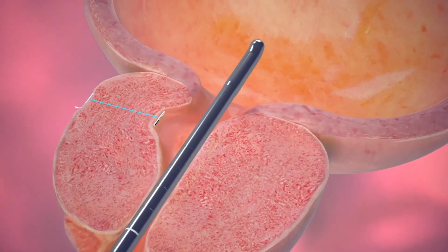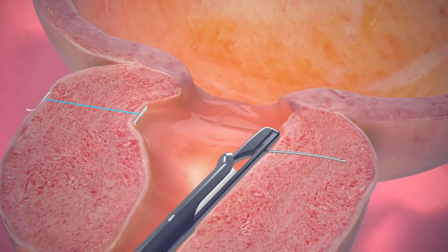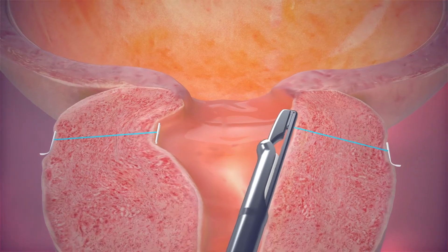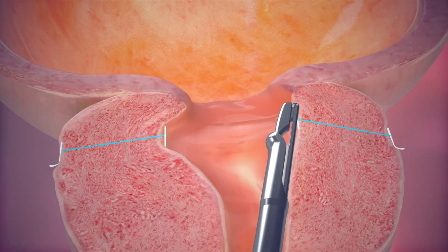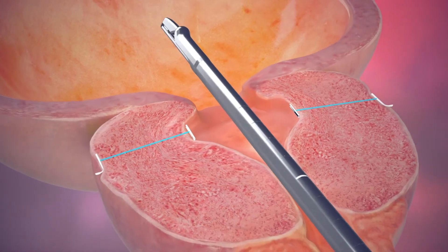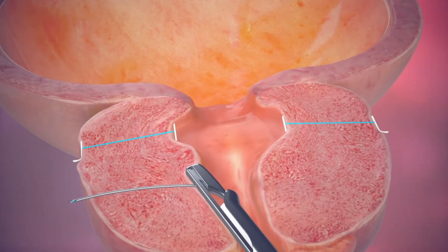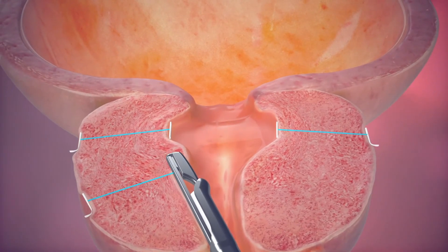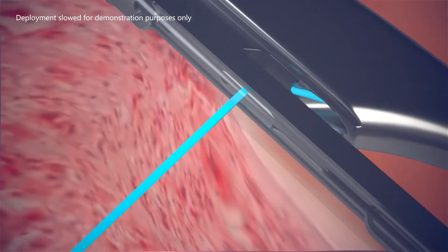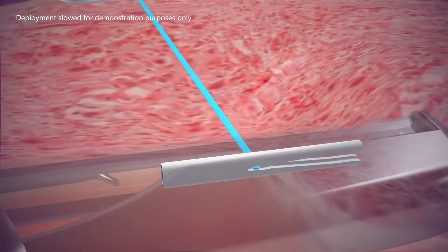Depending on the prostate size and amount of blockage, several more implants may be placed in the same way. Typically, four to six implants are placed into the prostate. The physician will determine the number of implants needed to obtain an open channel. The outer capsule of the prostate is firm and provides a solid anchor, allowing the implants to lift and hold the enlarged prostate tissue out of the way so it no longer blocks the urethra. The implant size is customized to each individual patient and prostate lobe.